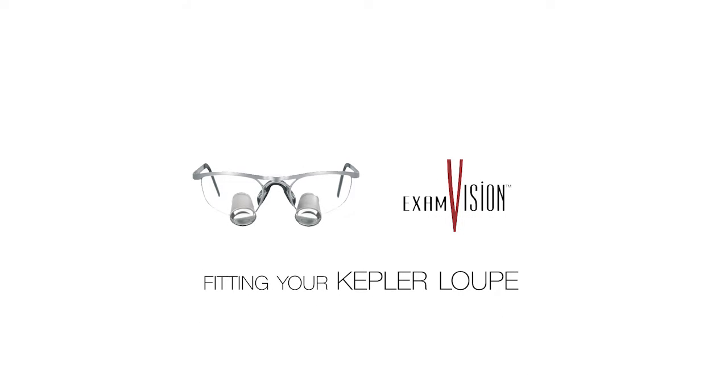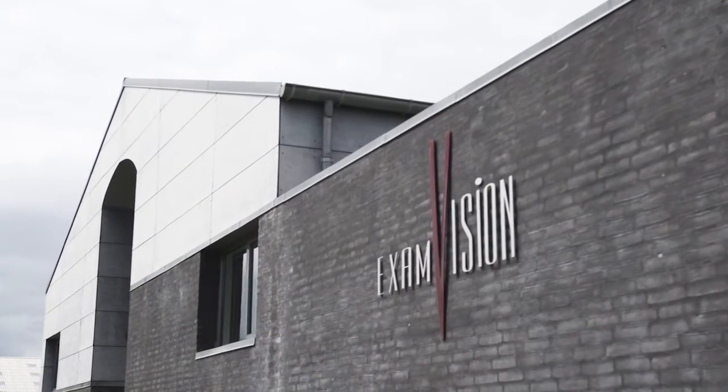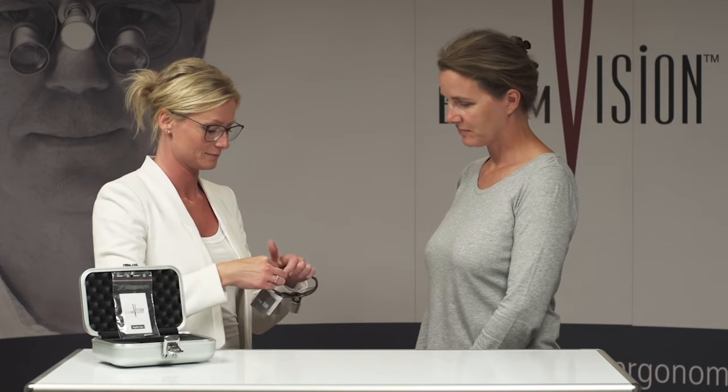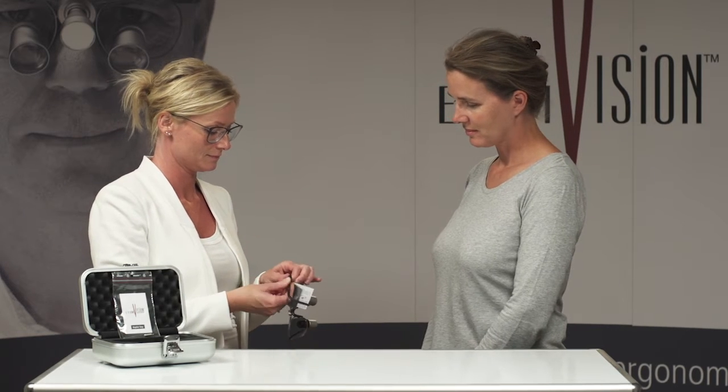Fitting your Kepler Loop. Congratulations on your new Kepler Compact Loop from ExamVision. This film will show you how to fine focus your loop.